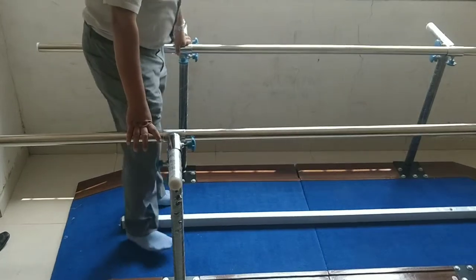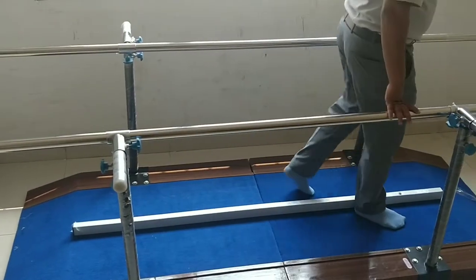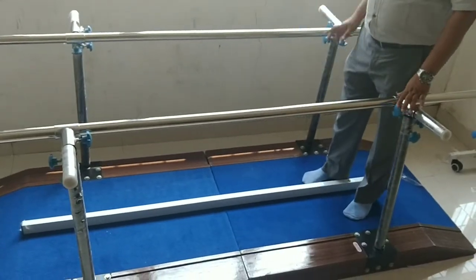And there is one separator bar. This is removable. You can also remove it and keep it if you don't want this.